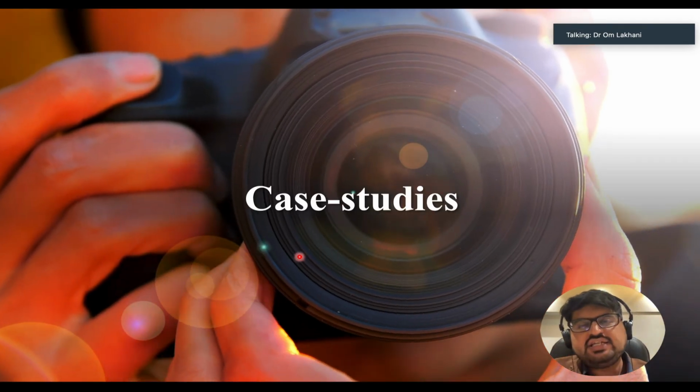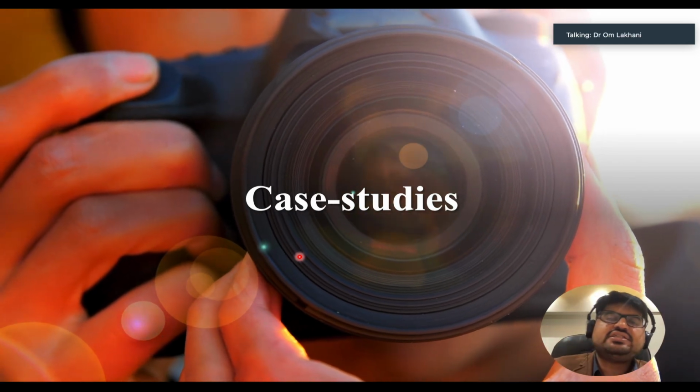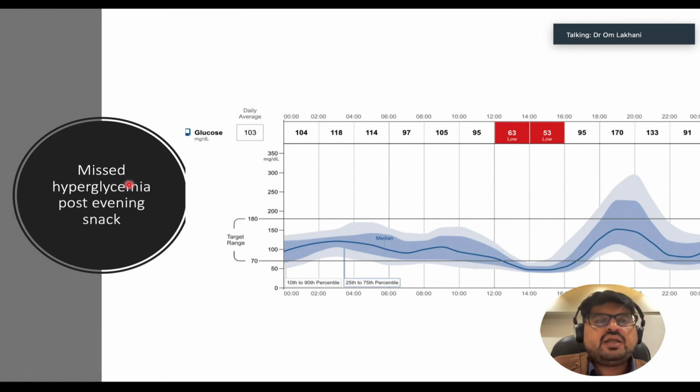So I'll give you some case studies to discuss how this has been really useful, some really interesting real life use cases for using a professional CGM. Let's say this patient had a fasting sugar of 105 or 95, thereabouts. The patient used to have a slightly late lunch, about 2 o'clock in the afternoon, and used to feel hypoglycemic before lunch, which was never checked on SMBG, and post lunch the patient had sugar values of 95 or so.